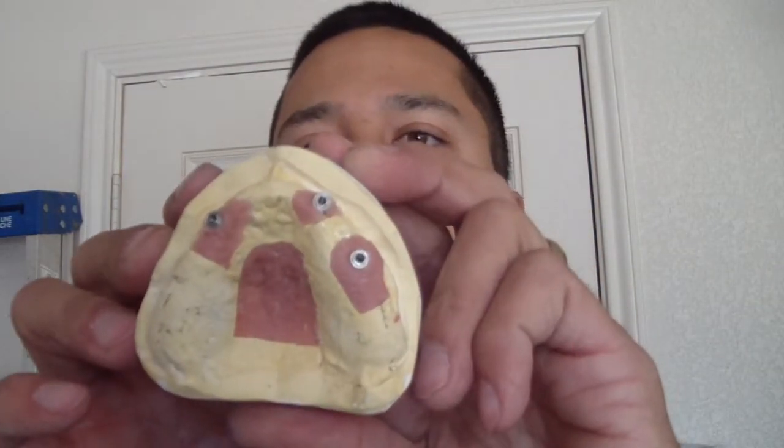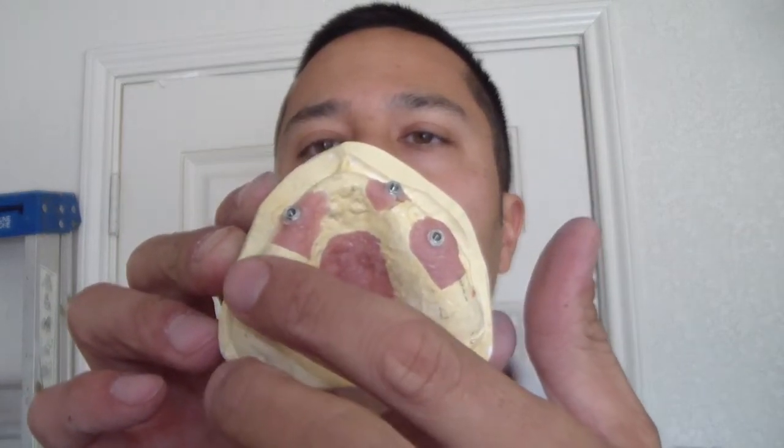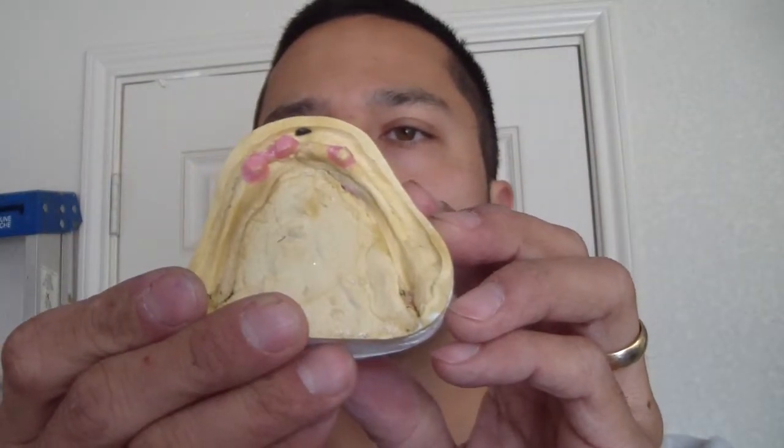Here's her maxillary cast, zoomed in. She's a fairly heavy smoker. She had six implants placed; two failed approximately in the right tuberosity region — right posterior maxilla — and now she has three that are serviceable. On her mandible, she also has three that are serviceable.